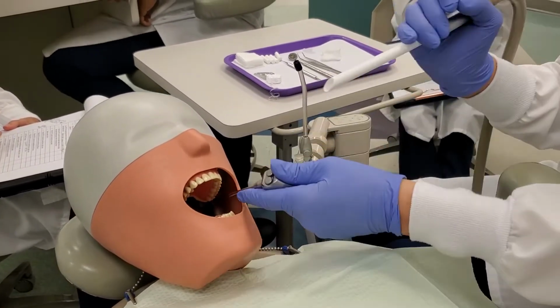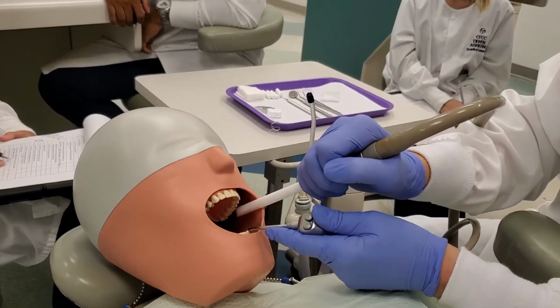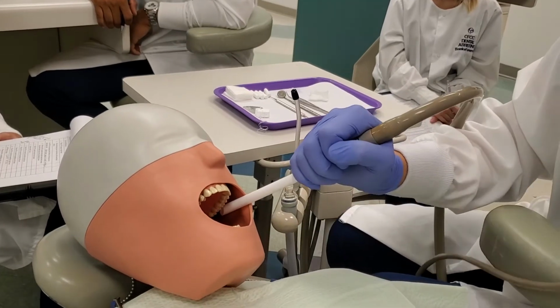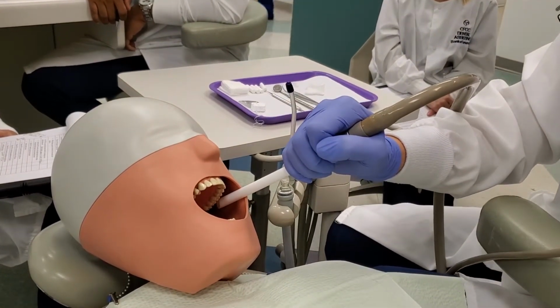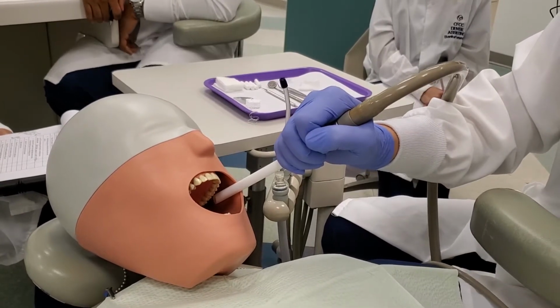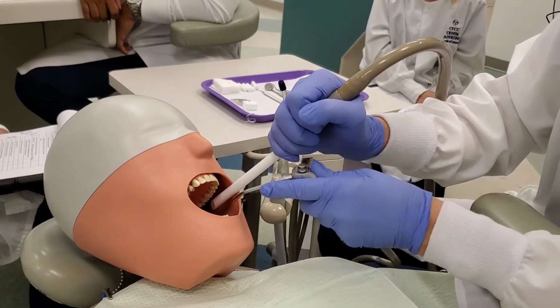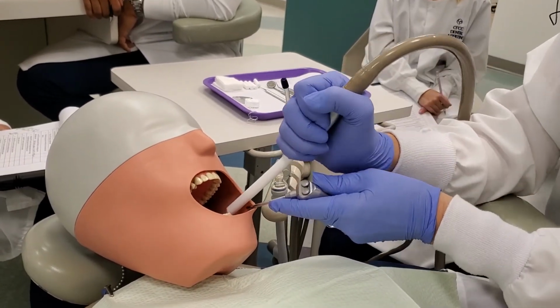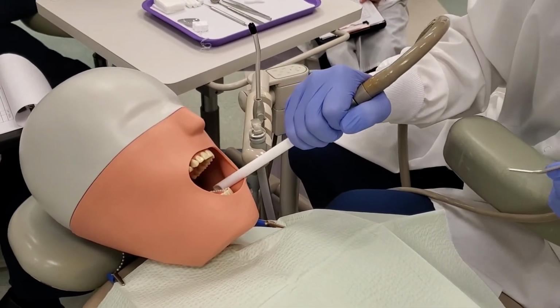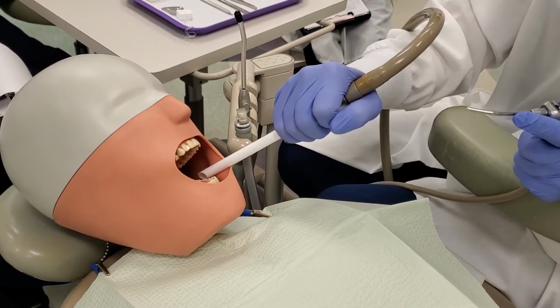Place the HVE to clear the maxillary left area. So again, you're going to retract, palm-thumb grasp. You're going to place it in the back. It's going to be parallel to the tooth, and that beveled edge pointing back towards the back of the throat, not touching the tissue. Place the HVE to clear the mandibular left area. So now you're going to come down. So again, use this to retract so you can place it where it needs to be placed and come on out. Same thing. Parallel to the tooth, pointed toward the back, not on the tissue.